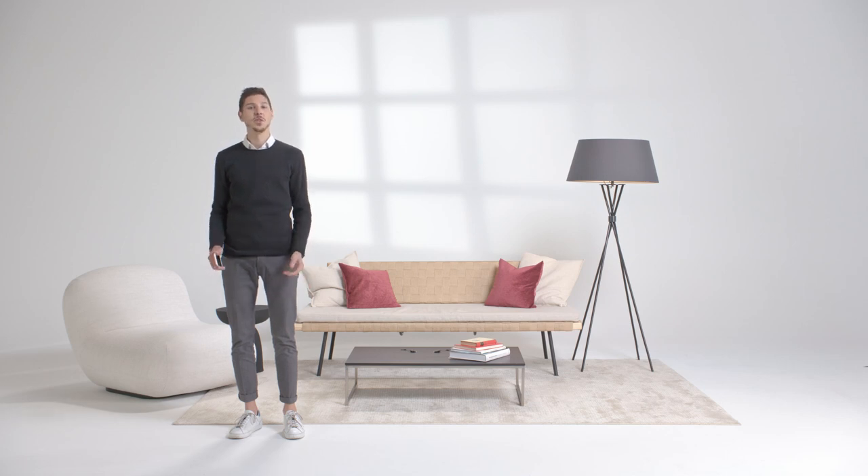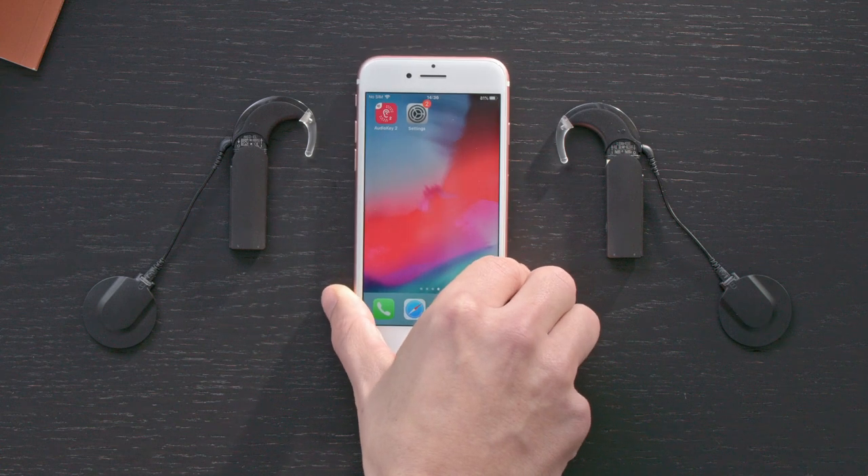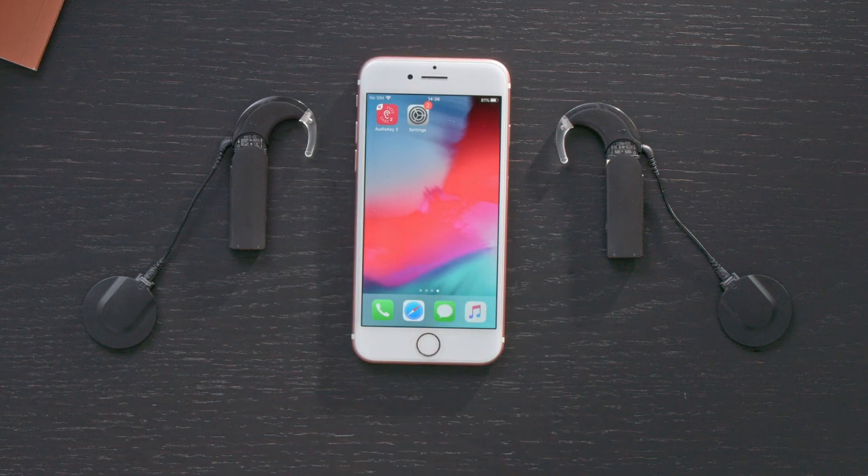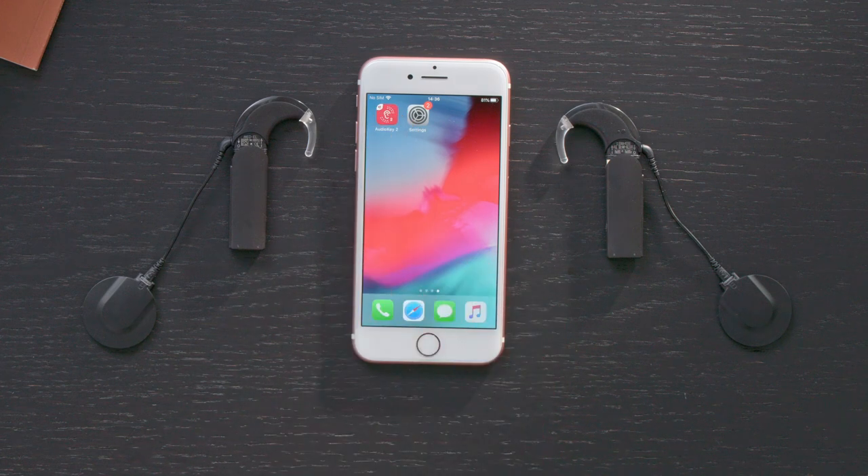Before using AudioStream for the first time, you need to configure it. This video shows you how to do that with an iOS Apple device. Before pairing AudioStream with your iOS device, download the latest version of the AudioKey2 app and enable Bluetooth on your phone.